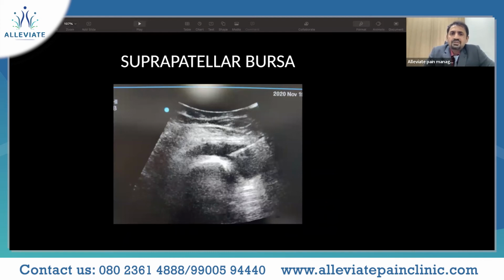But sometimes the patient presenting to us might be 120, 130, 140 kgs also. In these cases, it's difficult to actually appreciate with a linear probe. That's why I have put these images, because this was a female patient of 135 kg, and with the linear probe I couldn't appreciate anything. You can see that there is a needle coming there, and this is a curvilinear probe image. So it becomes much easier for us to locate the area because we are depositing precisely into that bursa.